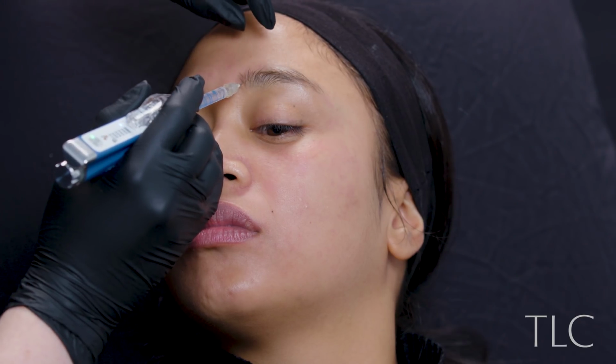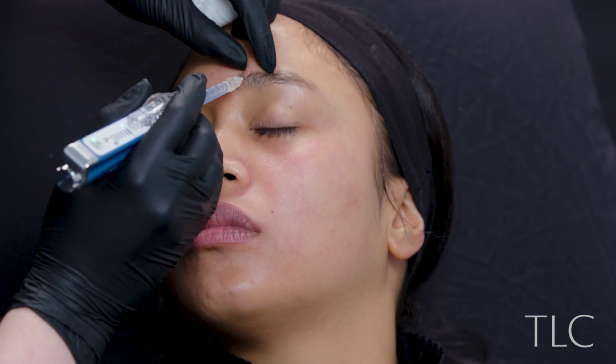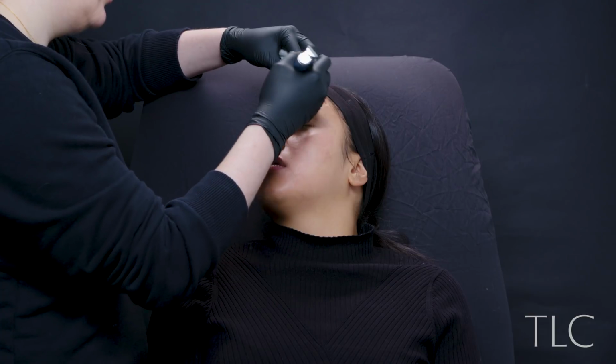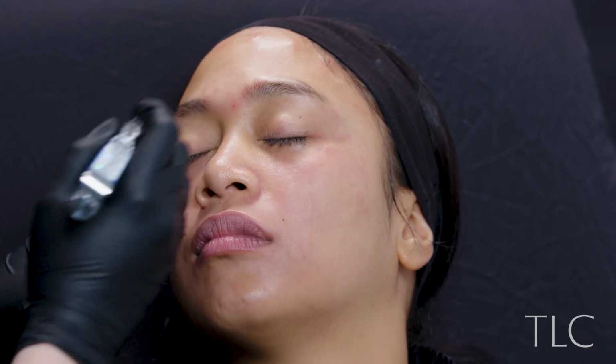So first up, let me just say her skin looks a little bit red because she has had a topical anesthetic put all over the face before we did the treatment today. And we started off by doing some Botox. This was done in the frown lines, the forehead, and around the crow's feet. Really, in her age category, it's just to give her a slightly more refreshed look and to almost allow a more serene expression. You'll see when we do the before and afters.